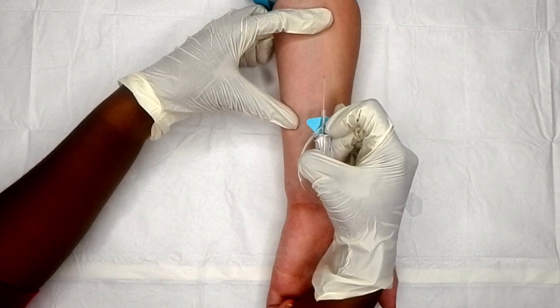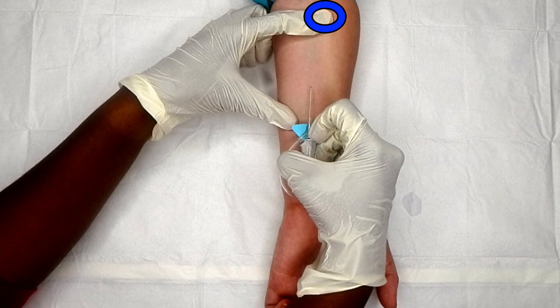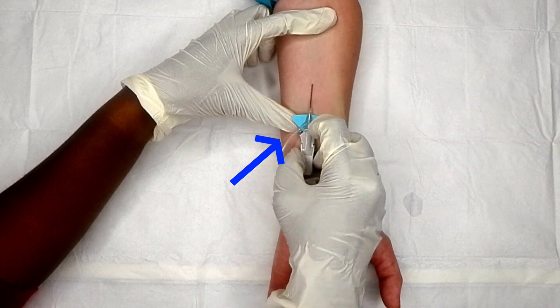Now I'm ready to place my IV. First, I like to do a tripod grip of the skin — anchor the skin from above, anchor it from below, and anchor the side for stability. This really minimizes the risk of that vein rolling, which actually happens to a lot of people. Also notice that my non-dominant hand is not in the way of my needle.